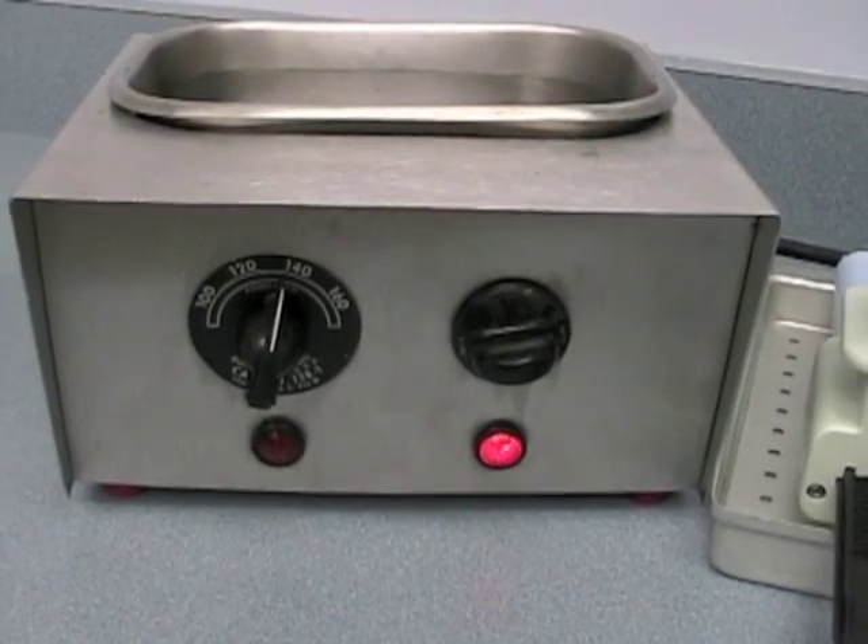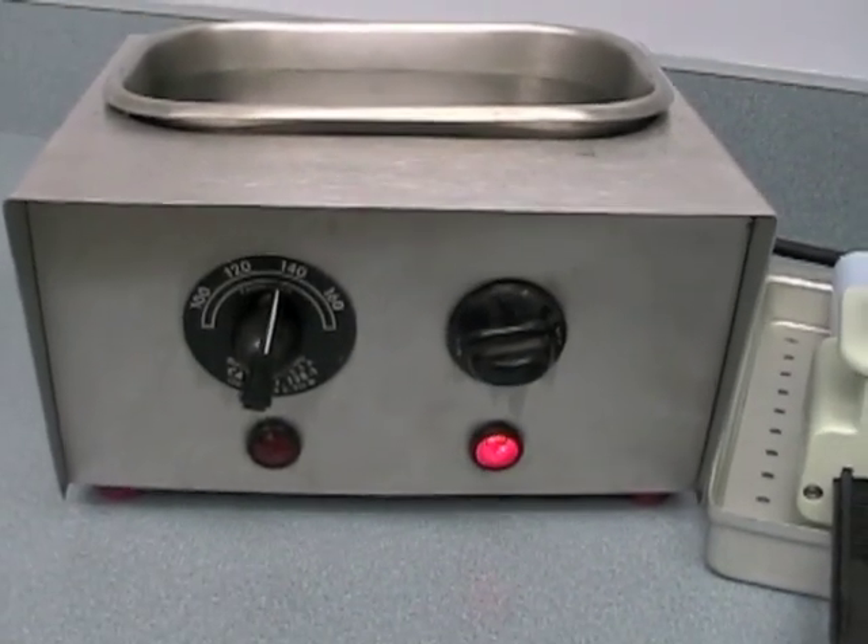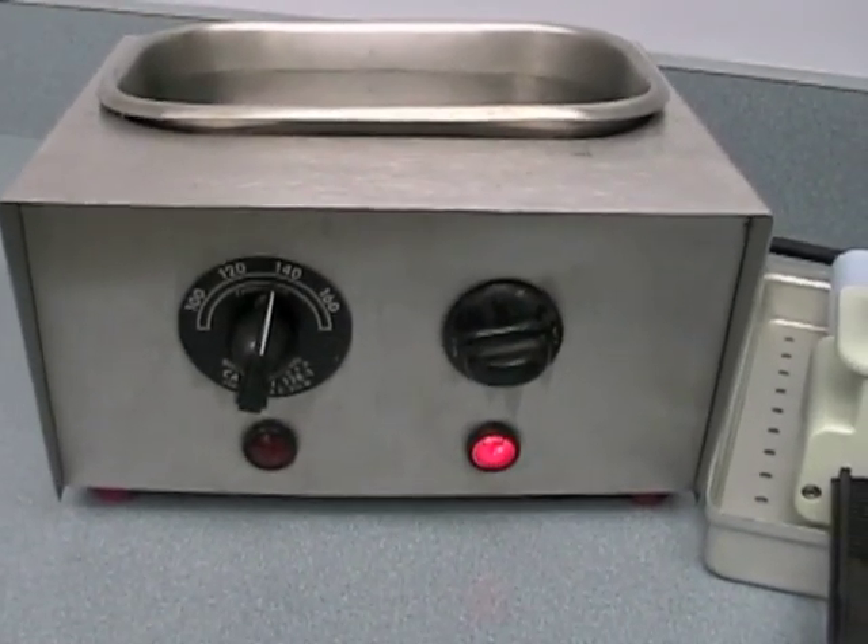Pour hot tap water into your hot water bath. Set the temperature dial to the 140 degree mark.